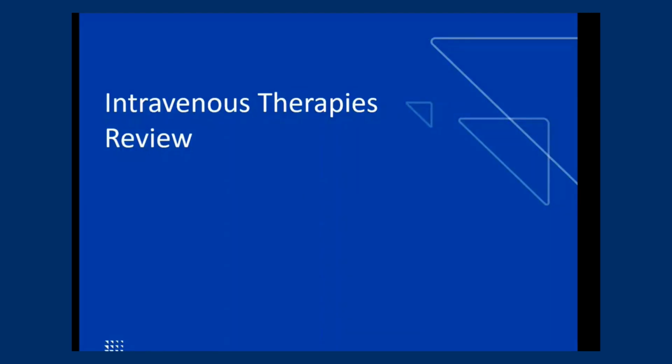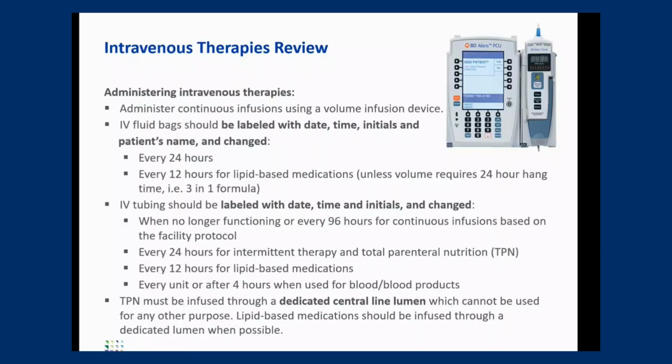Some intravenous therapy review. So all of our IV fluid bags should be labeled with date, time, initials, and the patient's name. And then in terms of changing these bags, we're going to change it every 24 hours, or every 12 hours for lipid-based medications. With our IV tubing changes, that should also be labeled with date, time, initials.